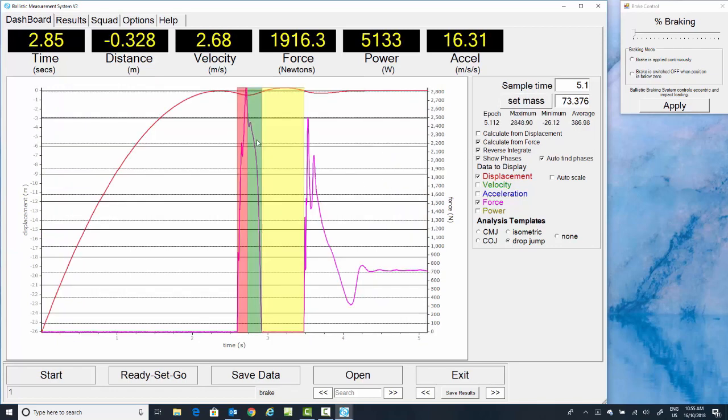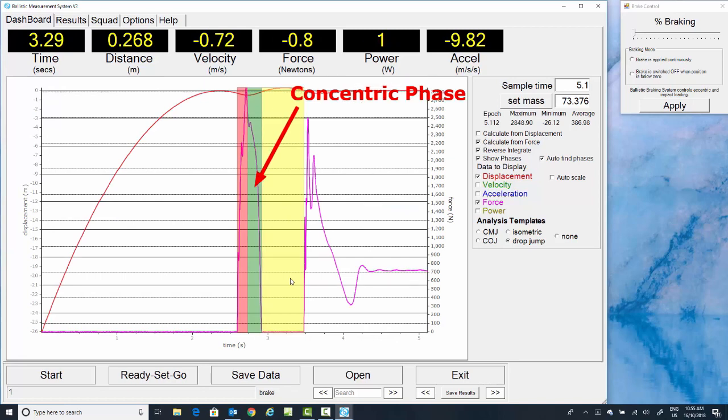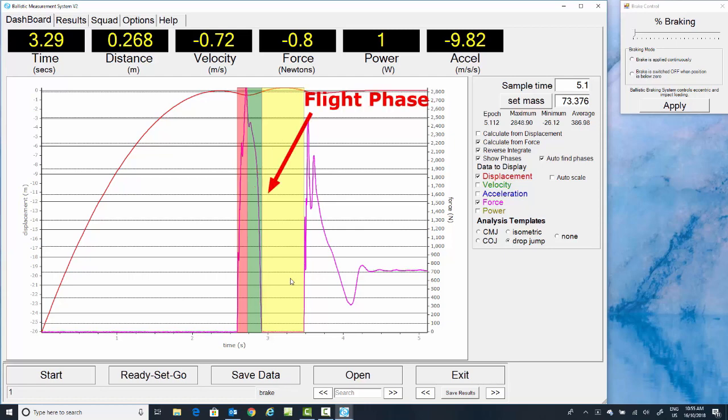Zoom back out, and you can see the eccentric phase, the concentric phase, and the flight phase.